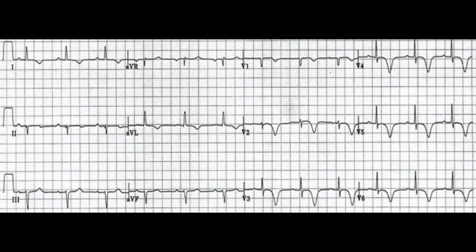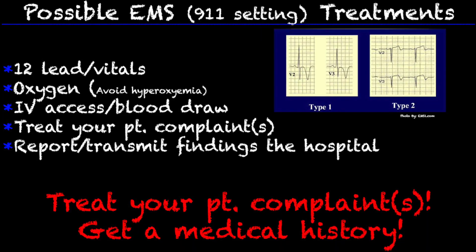Taking a look at Wellens' syndrome on a 12-lead, you can see there is T-wave inversion from V1 to V6, but there is very prominent T-wave inversion on V2, V3, V4, V5, and V6.